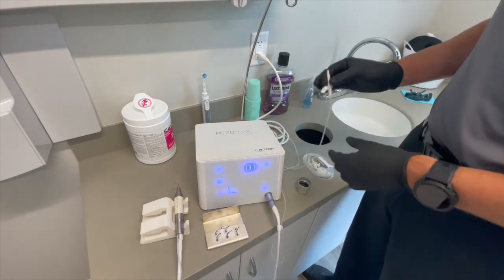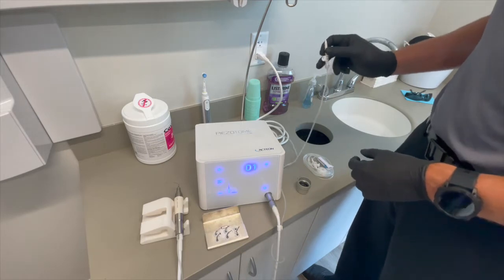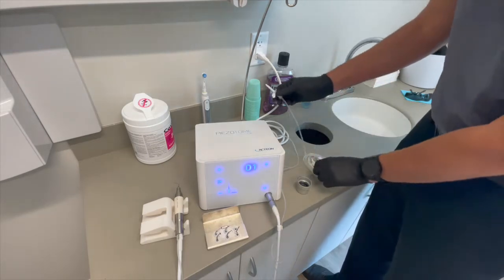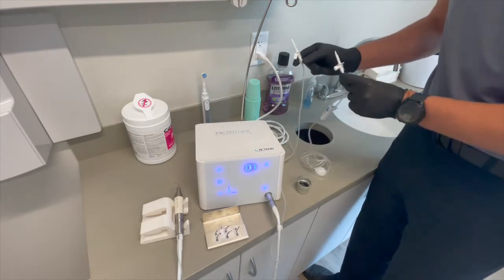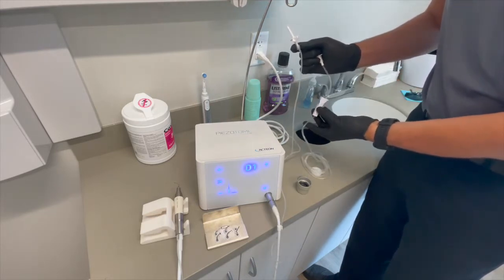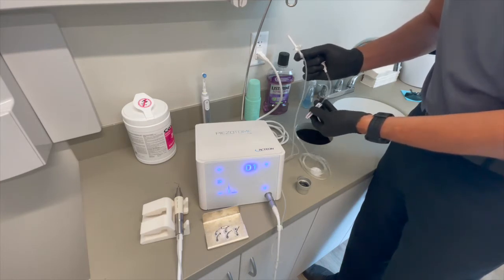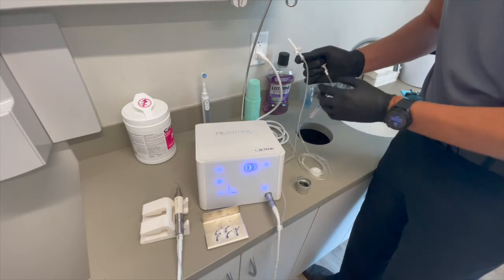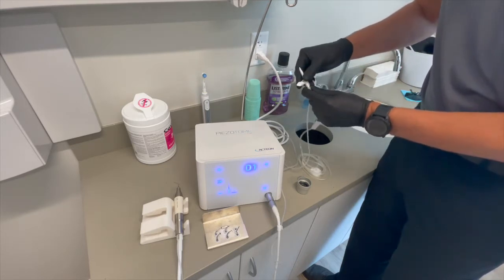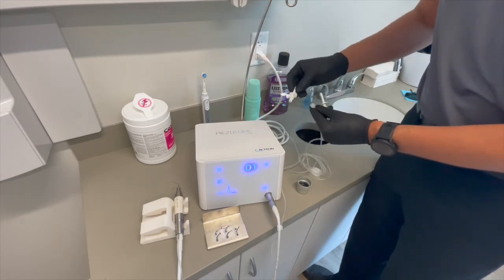From there, depending on which sort of tubing you are using — this particular tubing happens to be our autoclavable version, and we do have the disposable version next to it. The difference is the disposable version has a little on/off on it, while on the autoclavable version the perforators can unscrew.